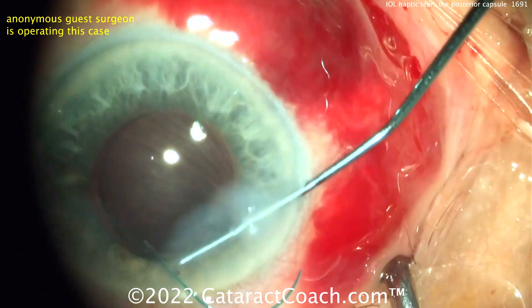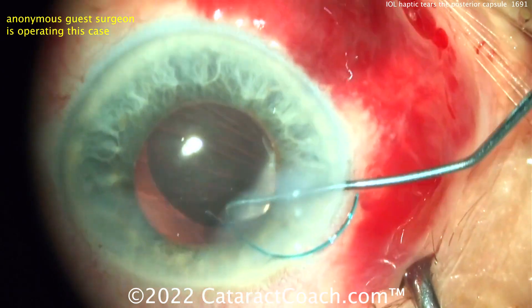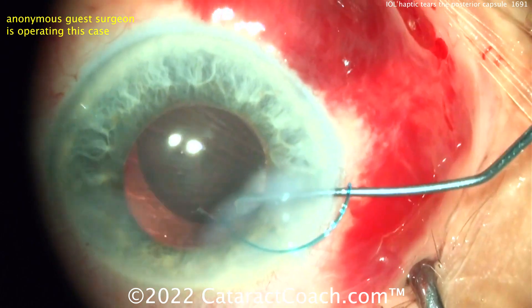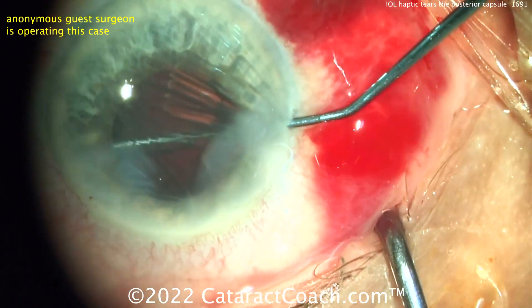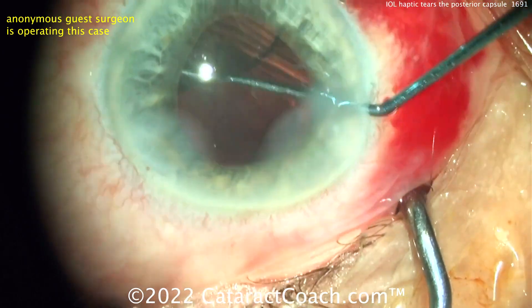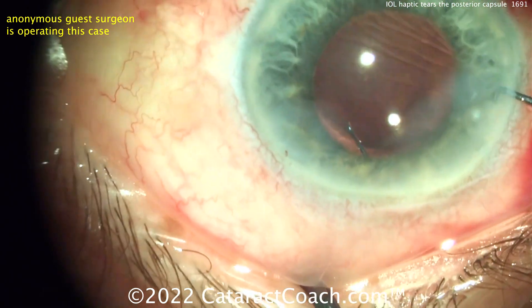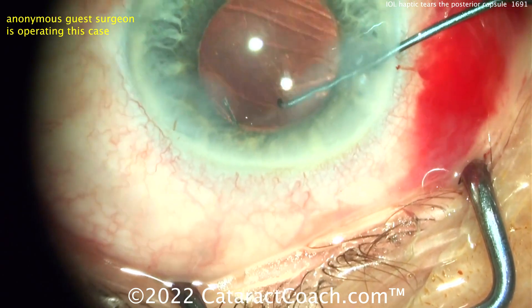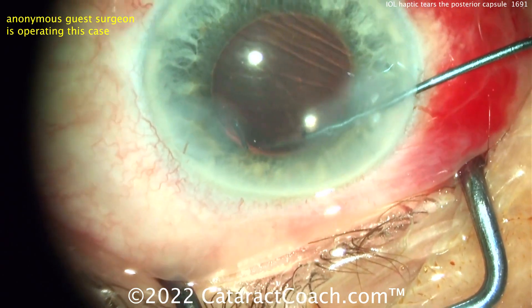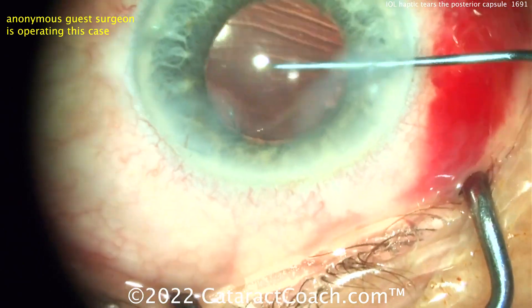Now in the correct orientation with counter-clockwise rotation, let's get that trailing haptic in and watch carefully. It's not going to be ideal — the trailing haptic is still not in the sulcus or the bag. Trying again with the Sinskey hook.